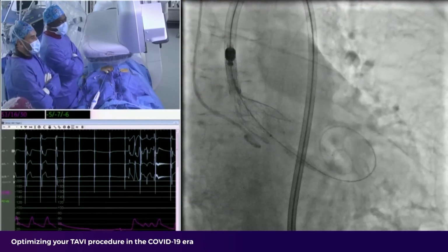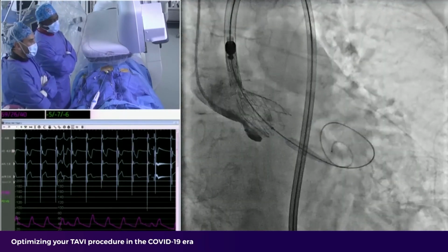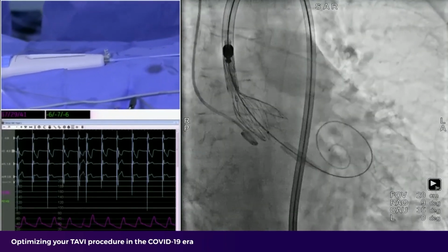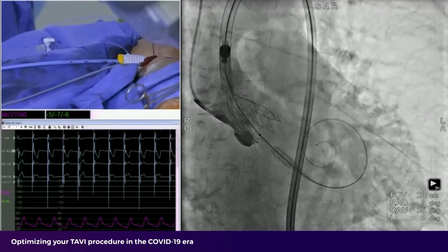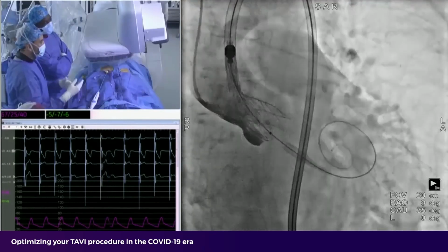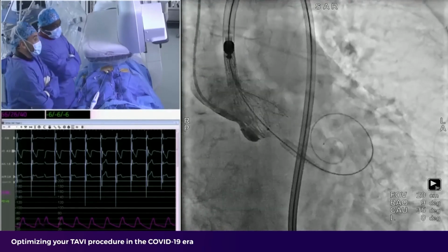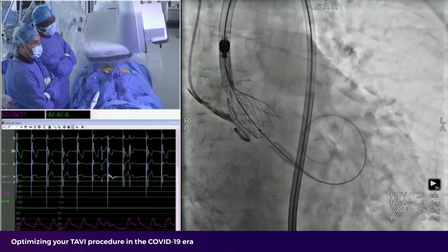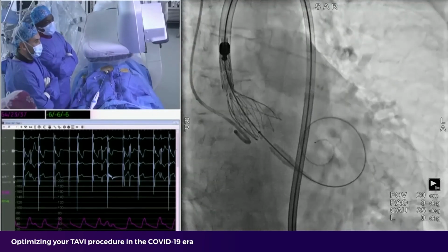What is important and interesting with this valve is that it's an intra-annular valve. Okay, good. We perfectly saw the stability it provides during the first phase of the deployment. And I think it's an important feature, especially in such anatomy, because it provides more accuracy to position your valve, to fine-tune your position. So here, I doubt we can position it higher. We can't be higher than that.